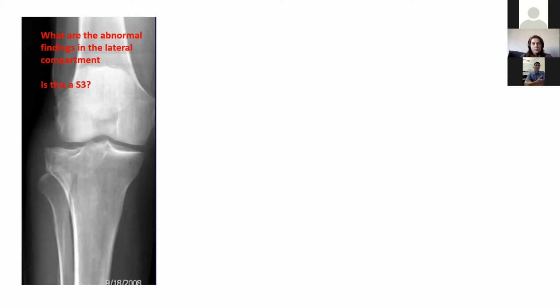When he did his description, he only had X-rays, and he couldn't really see metaphyseal exit points, so he may have called this a Schatzker 3. Nowadays, when we have CT and MRI, every single fracture has, even at the minute level, a coronal fracture plane. There's this controversy, though it doesn't really matter. We all treat these the same anyway. But yeah, S3s don't really exist. But you got it bang on.